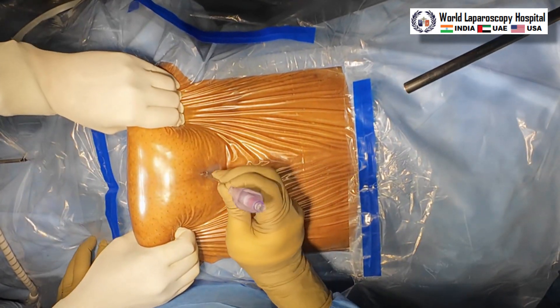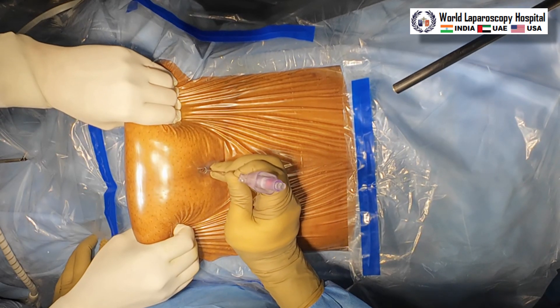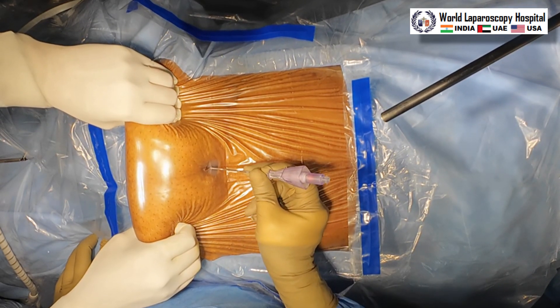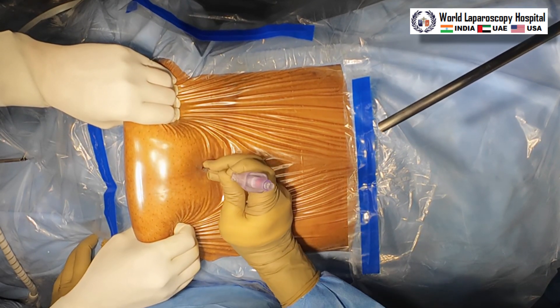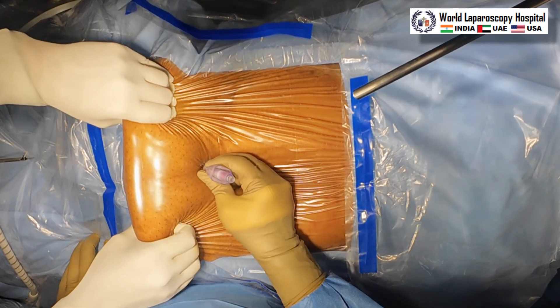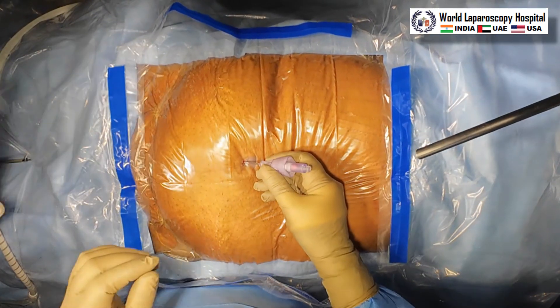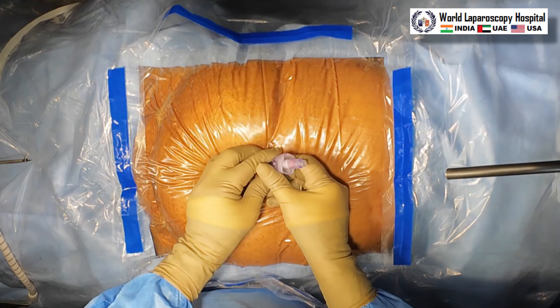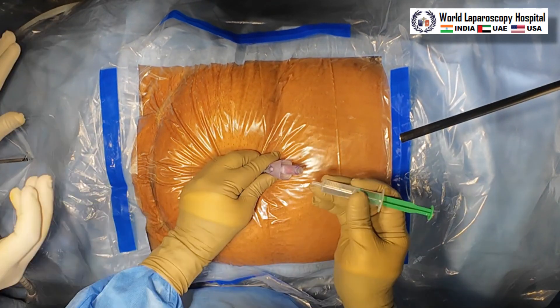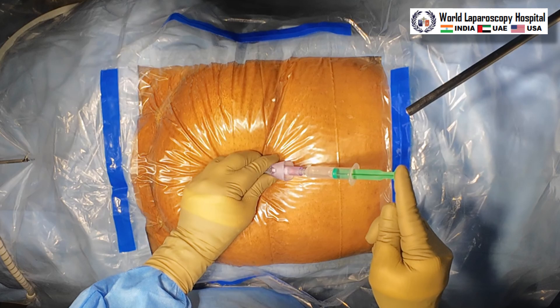Here the Veress needle is being put in from the inferior crease of the umbilicus because the patient is a little obese. So the umbilicus is displaced down, but the trocar we will put supraumbilical. This is the Veress needle being introduced; after that we will do irrigation, suction, and hanging drop test.